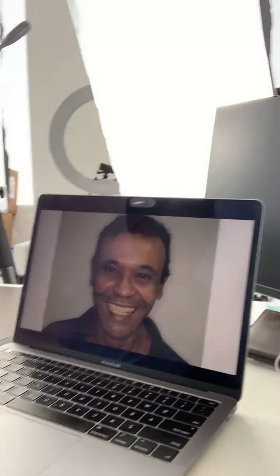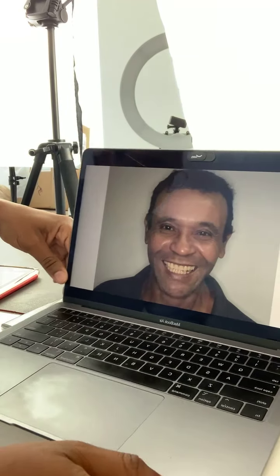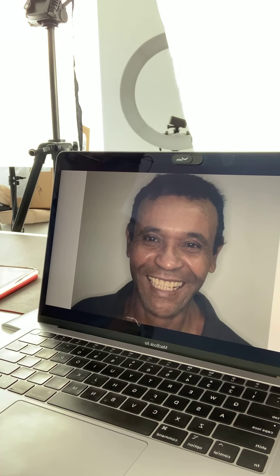Today, I want to talk to you about a special case that was done by me and Dr. Kleber in Brazil this January. This case is very special because we were able to work with our analog dental technician. I want to show you guys his picture. Here you go. Just let me know if you can see it. So this is the case that we're going to be discussing today. I'm going to show you how we did this, my design, and how the workflow actually worked.